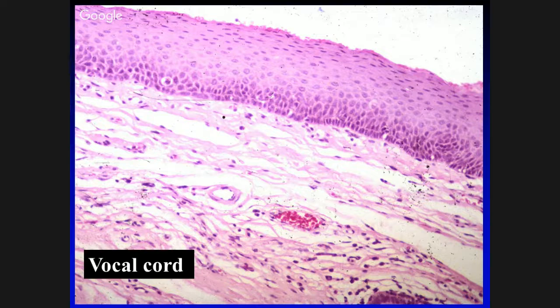So you've all looked at epithelium, and you should know by now that everything starts in terms of proliferation from the basement or the basal zone. There's a relative basement membrane. You could see this sharp separation from the submucosa. This is the larynx. This is in particular the vocal cord area. It's a non-keratinizing surface squamous epithelium. As you go from the basement membrane to the surface, you get maturation. Can you find mitoses in the basal zone? Absolutely. But pay attention to architecture. It's flat, and there's no dysplasia, no cytomorphologic features of dysplasia, which we'll go through.